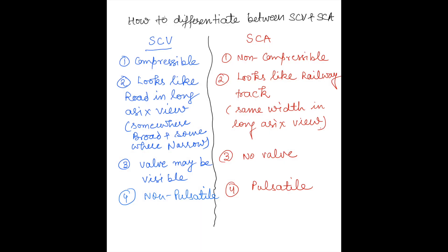To differentiate between the subclavian vein and subclavian artery in long axis view: the subclavian vein is compressible and the subclavian artery is non-compressible. The subclavian vein looks like a road — broader in some areas and narrower in others — whereas the subclavian artery looks like a railway track, with the same width all the way through. The vein wall may be visible, while there is no visible wall in the artery. There is no pulsation in the subclavian vein, while the subclavian artery will always be pulsatile.